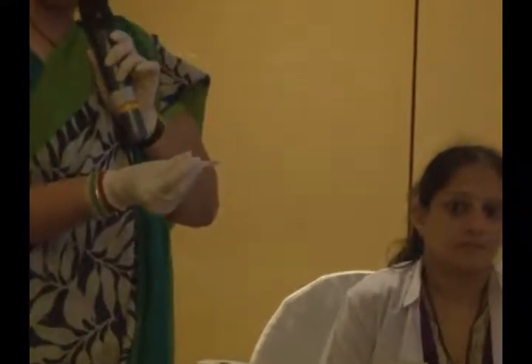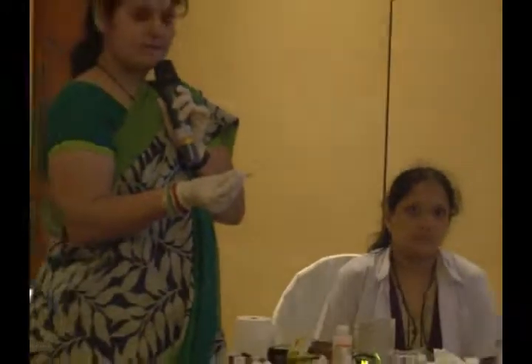See, you have to load the sample underneath the medium. So now you have to go down to the bottom of the tube and then load the sample.